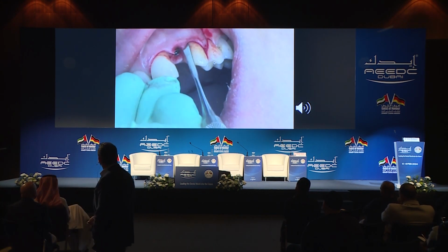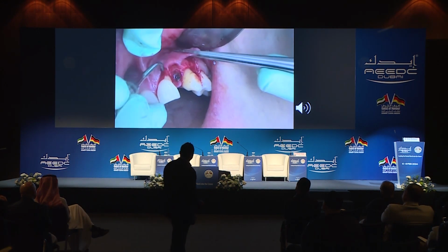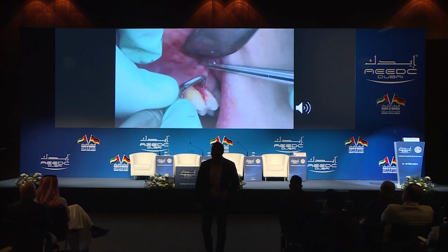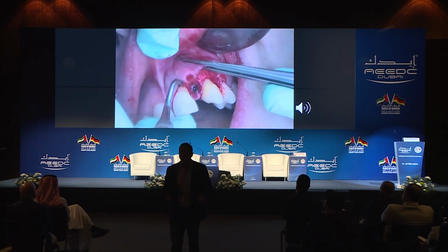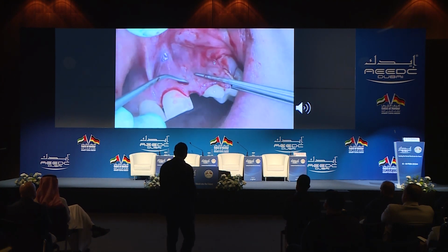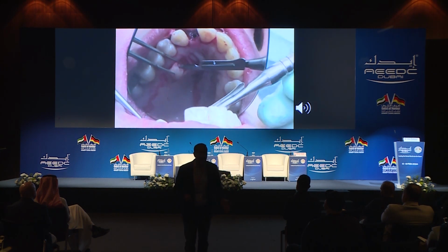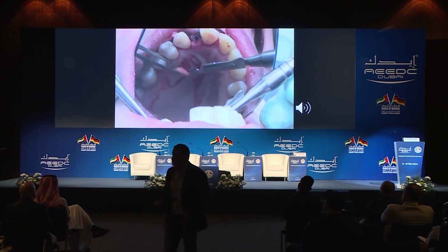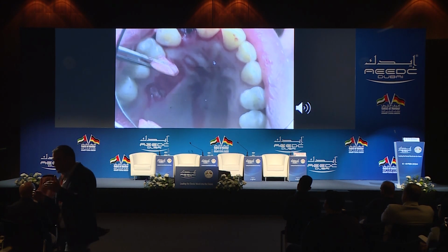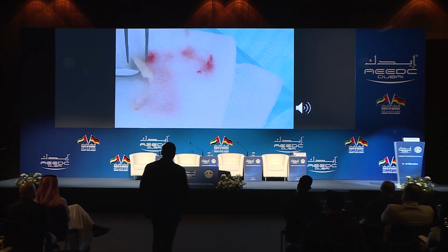We try to keep the papillas if we can, and then we stretch the tissue to move everything coronally because we're going to put this implant to sleep. So if we're planning to put this implant to sleep, you have to have a passive suturing on the top of this implant. So here we flap everything, take the connective tissue, place the connective tissue, same technique, harvested, free, converted into connective, place it in 2 dimensions, vertically and horizontally, because we're trying to gain volume, not just in 1 dimension, but in vertical and horizontal dimension.